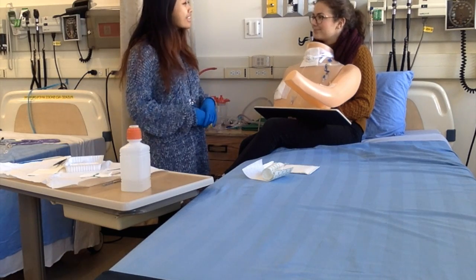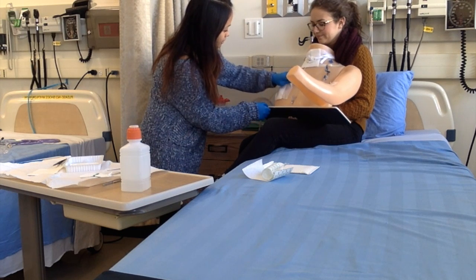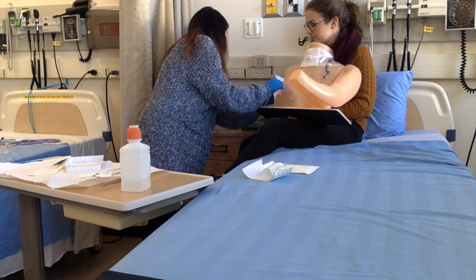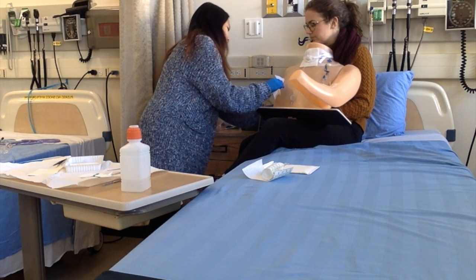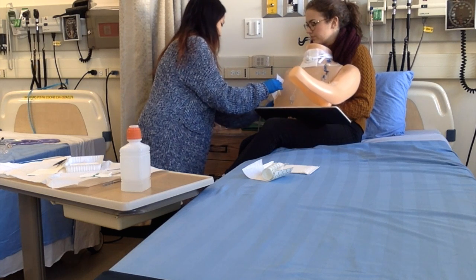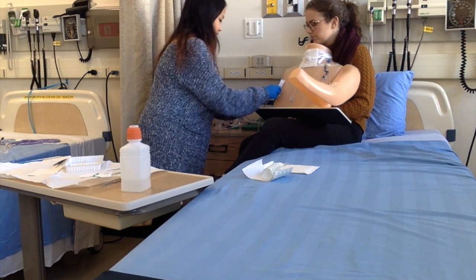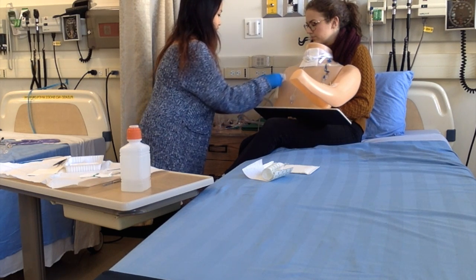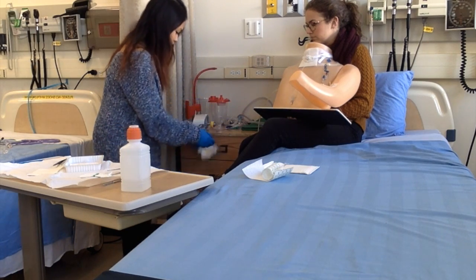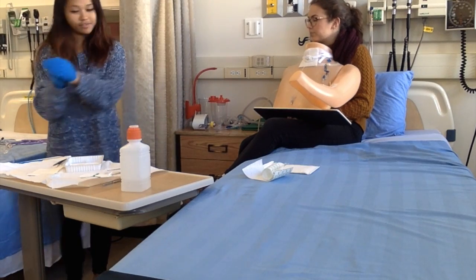I'm just going to remove your dressing now, okay? Drainage, that's okay. I'm just gonna go get some new gloves. I'll be back.